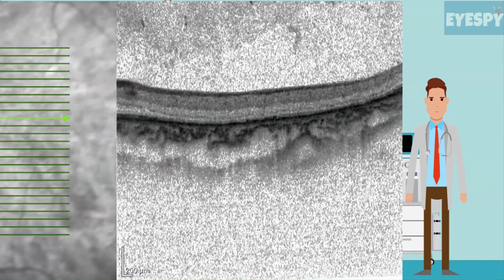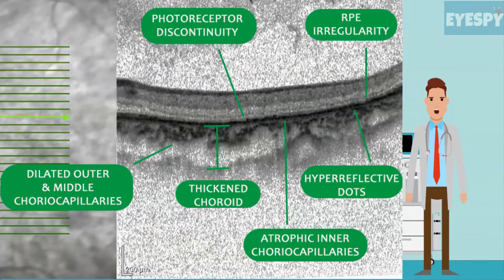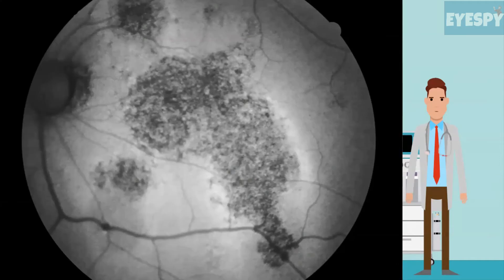OCT is an important imaging modality in cases of CSCR. Features to be noted in this case are increased choroidal thickness, dilated outer and middle choriocapillaries, atrophic inner choriocapillaries, hyperreflective dots in the inner choroid, irregularity in the retinal pigment epithelium, and discontinuity in the photoreceptor layer.